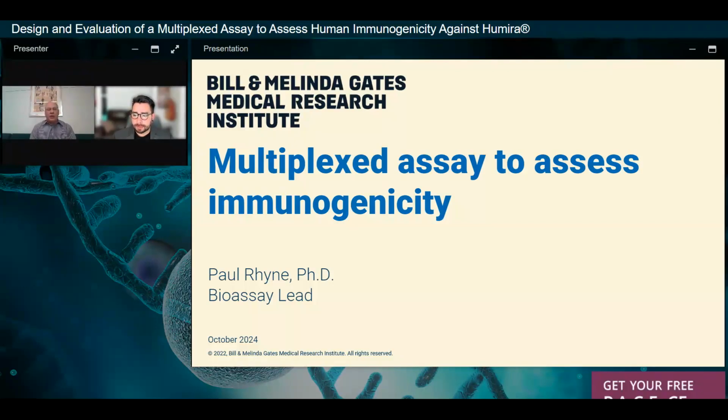in your patient samples you still have the presence of the drug these patients are being treated with, and the presence of that drug can interfere with the detection of these antibodies. So the drug tolerance for these assays was around 10 micrograms per ml. Actually, I think it was 50. So it was fairly high for Humira.